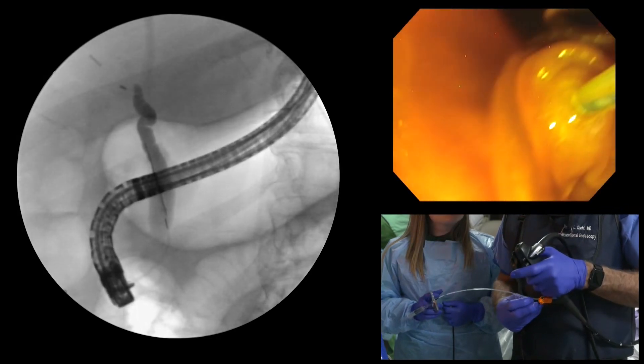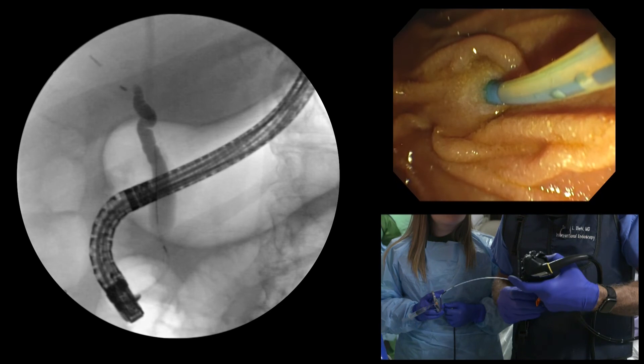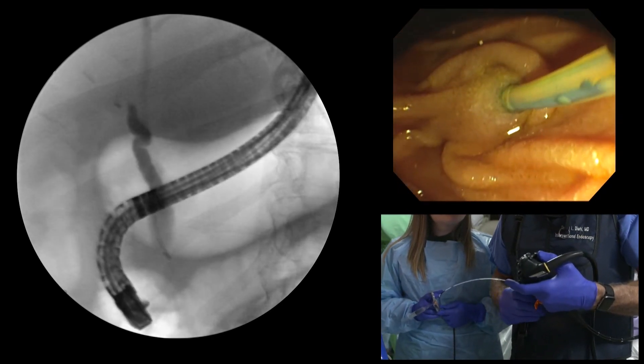Second, the short guide wire allows physician-controlled guide wire manipulation, which can be a distinct advantage in efficiency.